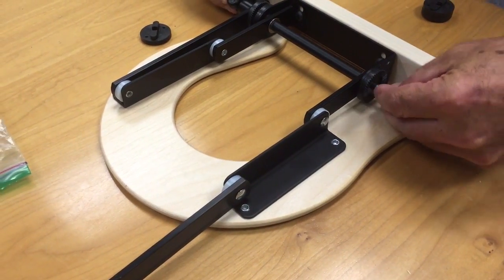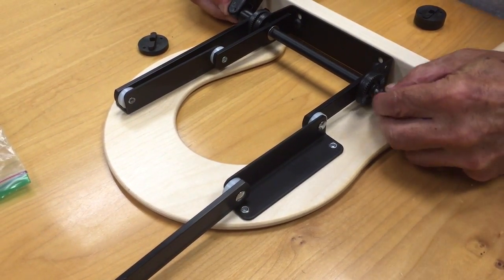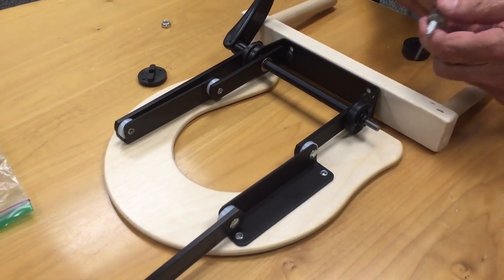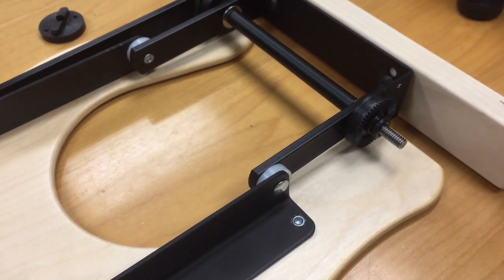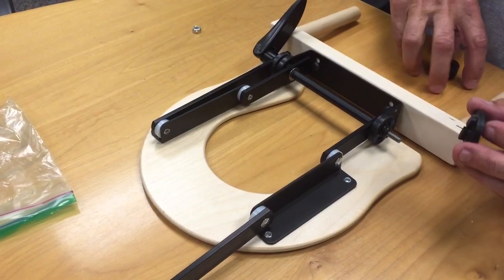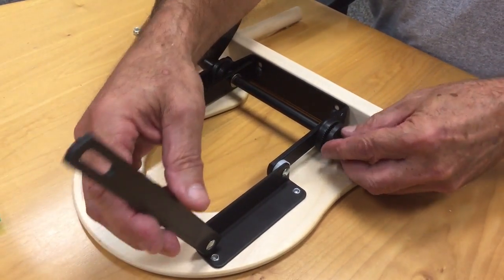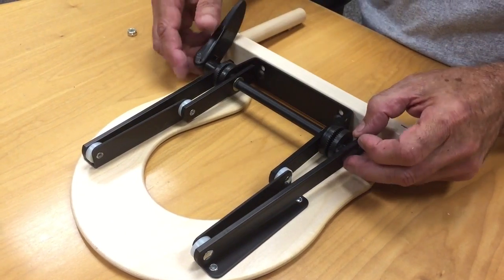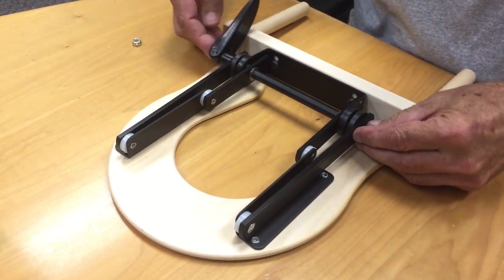Next, the 2 remaining O-rings slide in just like the previous ones. They do require a very small drop of oil. Then there is a little bit of play, so you're able to push that over there and get over top of the bar of that disc.